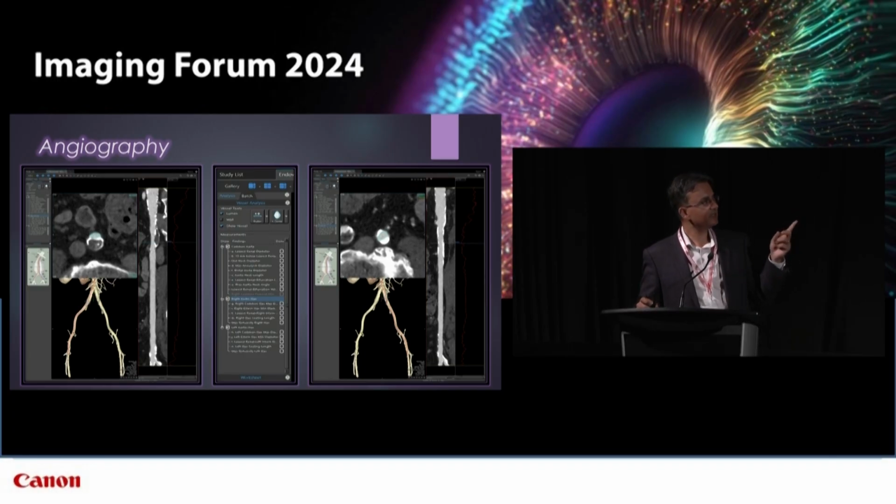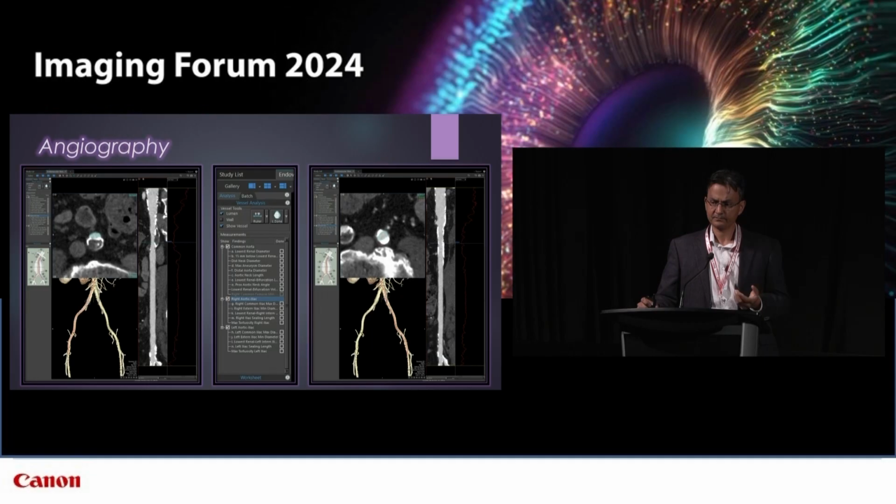The other nice thing, though, about this straightened MPR and volume rendered image together is it actually provides a really quick qualitative assessment of plaque burden and tortuosity, which are also important in the team trying to assess whether they can pass a catheter through that vascular tree, i.e., are they at risk for distal thromboembolism? Are they at risk for inducing an iatrogenic dissection in certain scenarios?